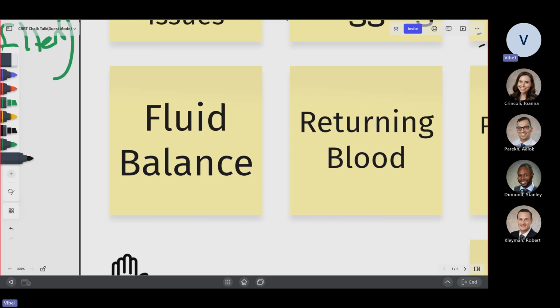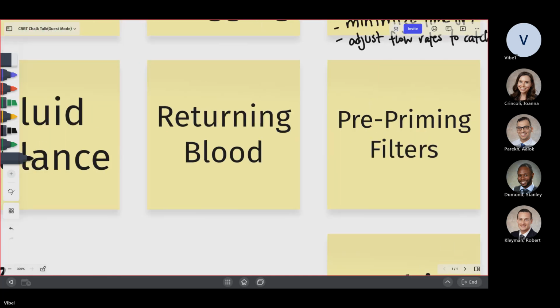Most nurses here do practice that when ending CRRT. It's done in both regular hemodialysis and CRRT; the nurses try to minimize the blood loss. There are protocols for it.